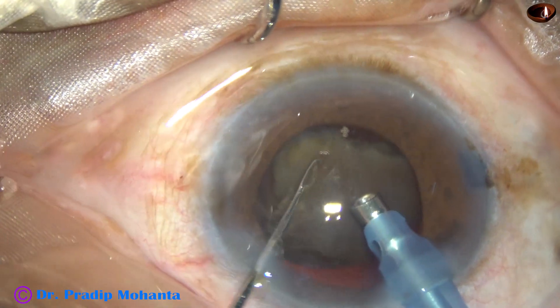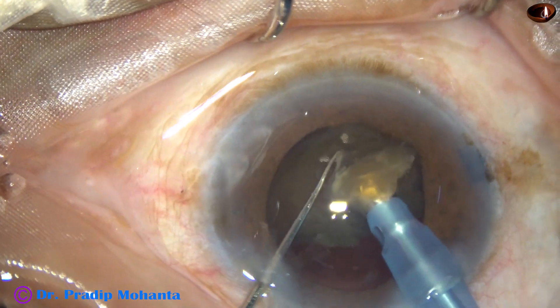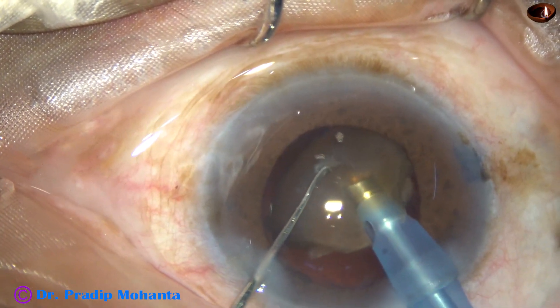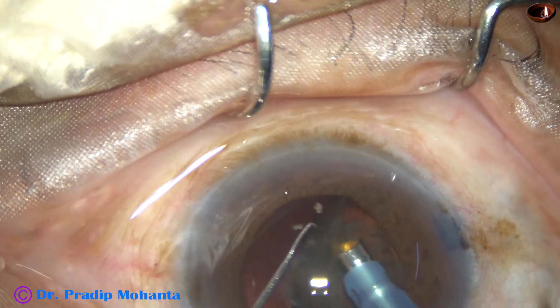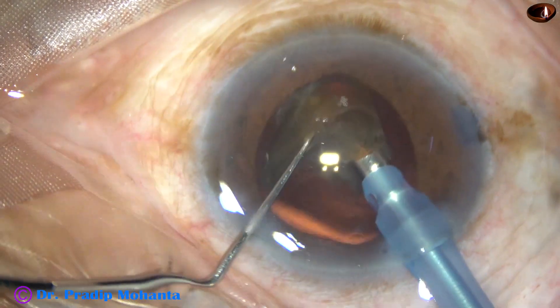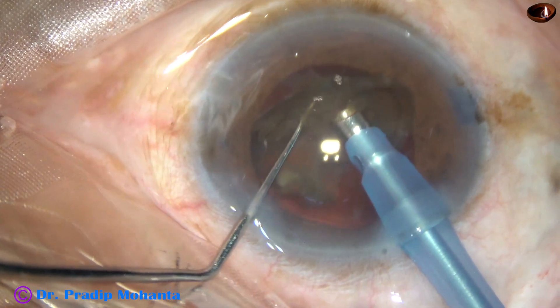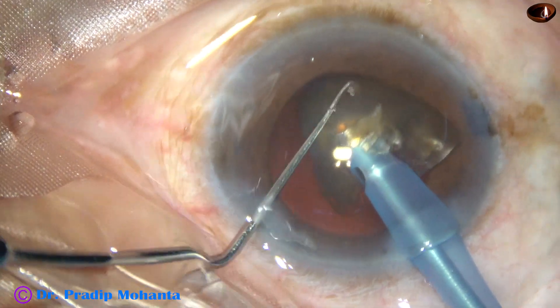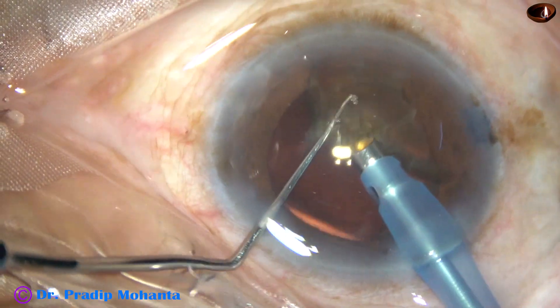Now comes the tricky part. Though the chamber is stable and there is no surge, there is still a risk of posterior capsule rupture during emulsification of the last piece. There is no epinuclear cushion — just hard nucleus and then the posterior capsule. We can decrease the parameters, decrease the vacuum and flow rate, and emulsify the last piece. But the safest technique, after so much hard work, is using an IOL as a scaffold for emulsification of the last portion.